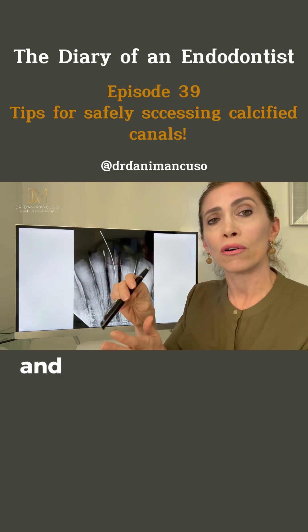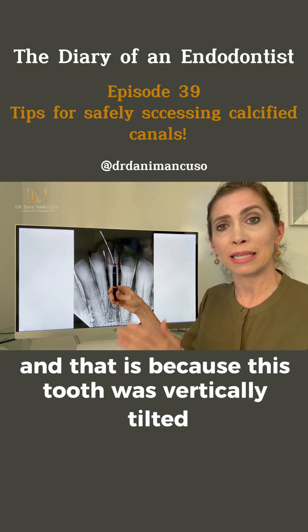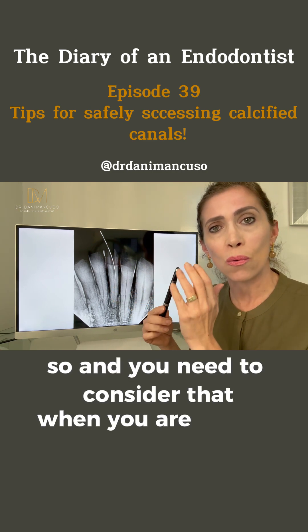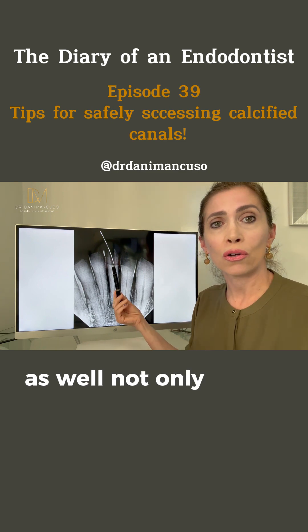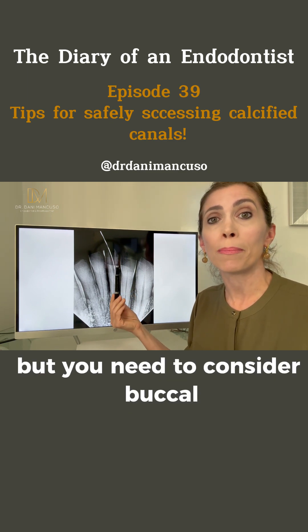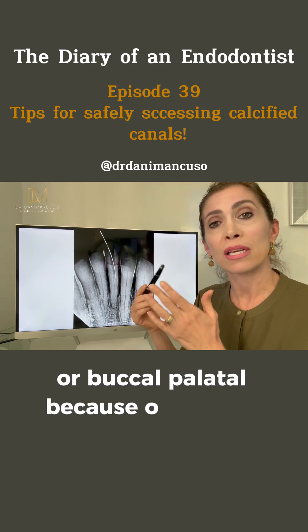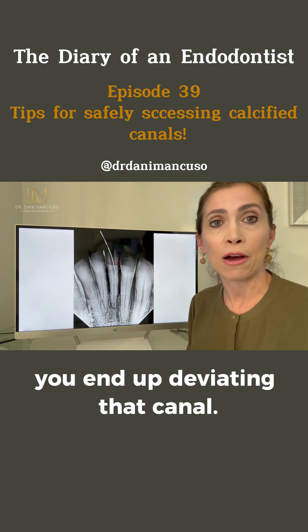The buccal was slightly angled toward the front because this tooth was vertically tilted. You need to consider that when you are drilling — not only mesial-distal, but also buccal-lingual or buccal-palatal — because otherwise the file will end up deviating the canal.